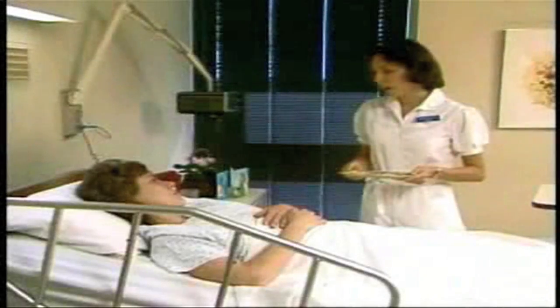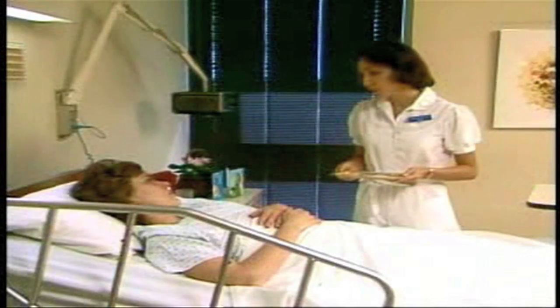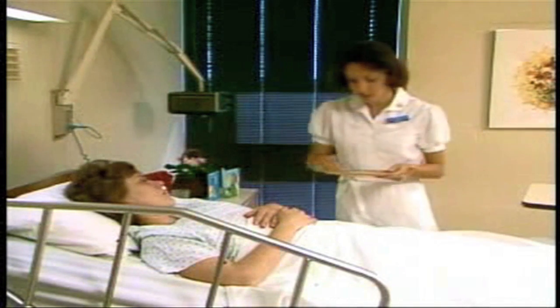Mrs. Dowd, I have the penicillin that Dr. Wayne ordered for you. Are you allergic to penicillin? Always provide explanations to the patient about the injection and check to be sure you are giving the right patient the correct medication.